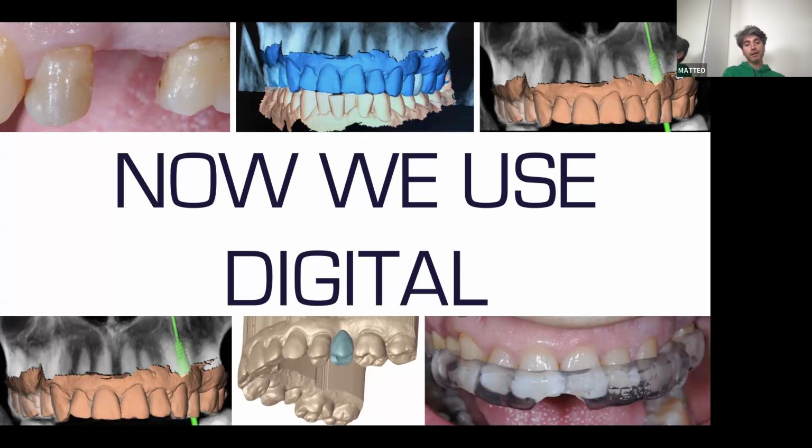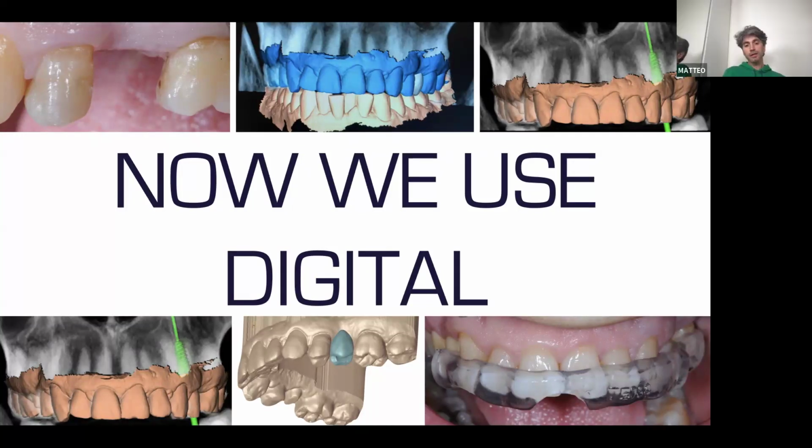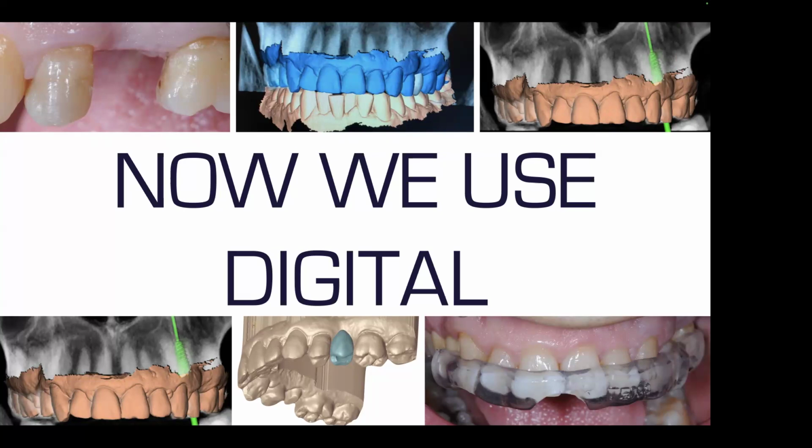Okay, like intraoral scanner. And the CBCT.